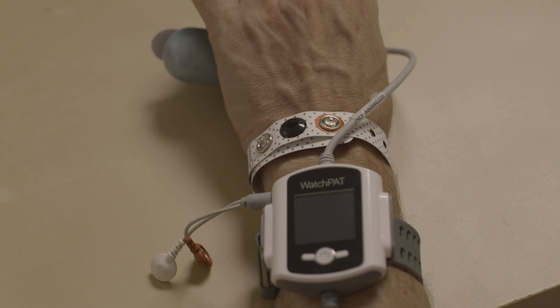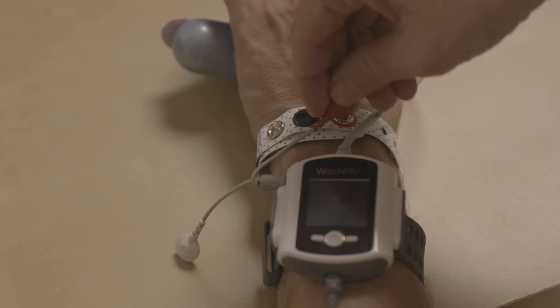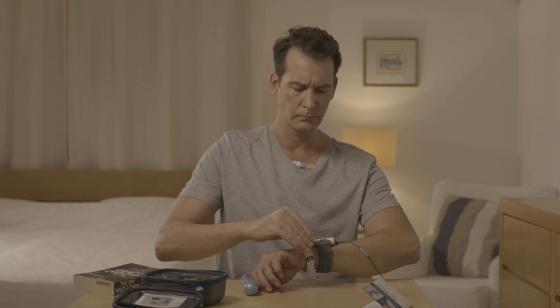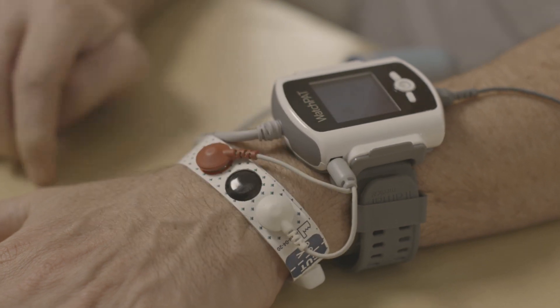Verify that the cable with the red and white snaps is well connected to the WatchPad socket. Connect the white and red wires coming out of the device to the white and red snaps of the bracelet, respectively. Make sure you hear a click when attaching the connector.